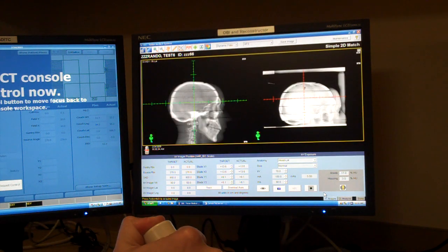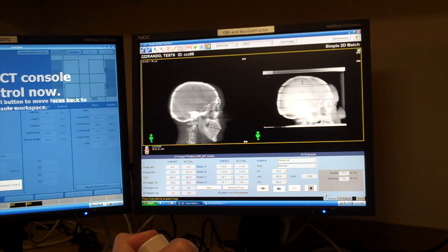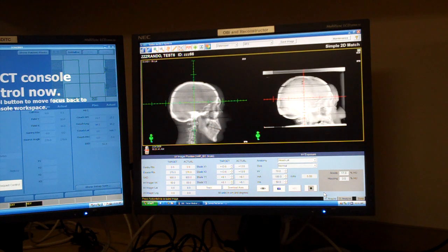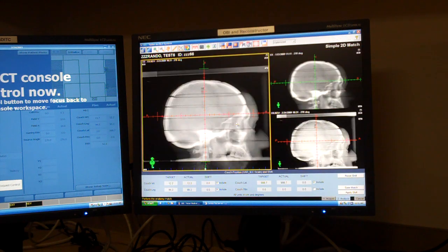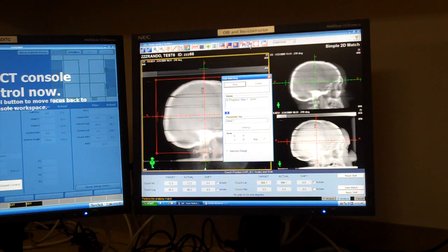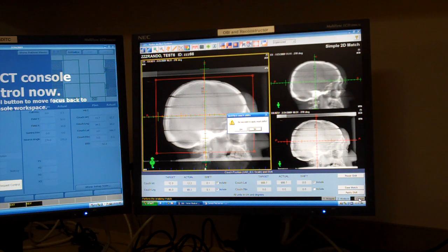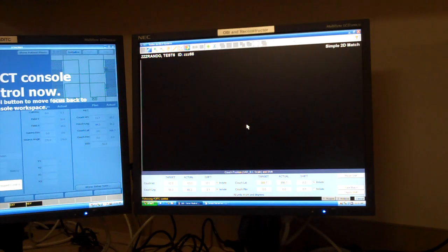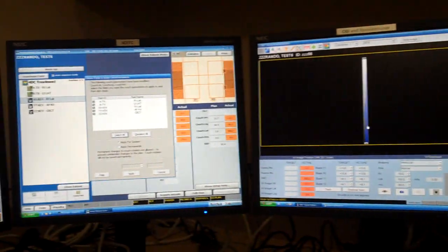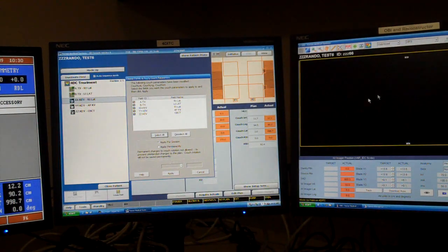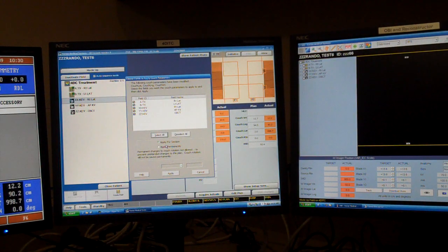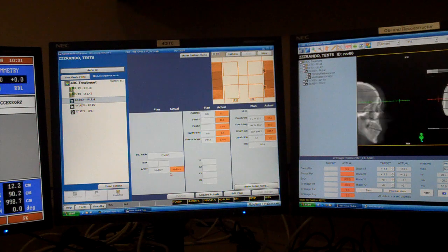I go back to Acquire and get another image, which you can see is now aligning very well. I go to Analyze, do another 2D match and verify. My shifts are 1 mm and 1 mm, so I feel I'm in a good spot, and I will cancel this and not apply couch shifts. It says my couch coordinates have changed, so I will apply these new couch coordinates just for the session.